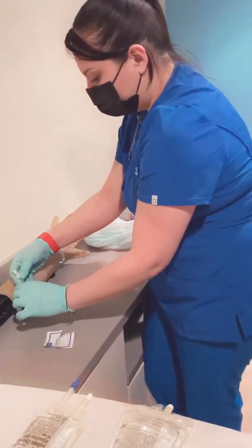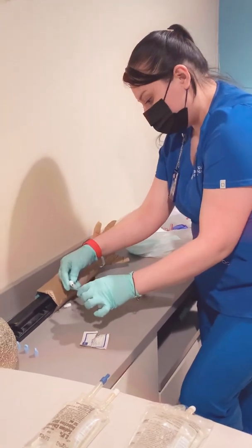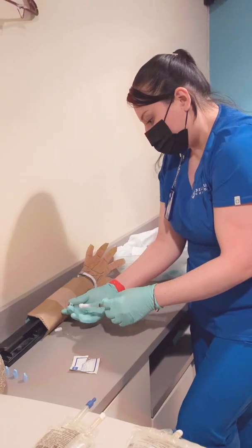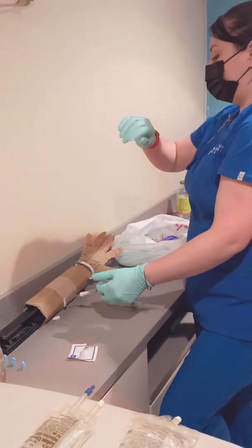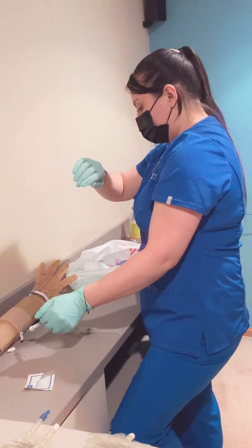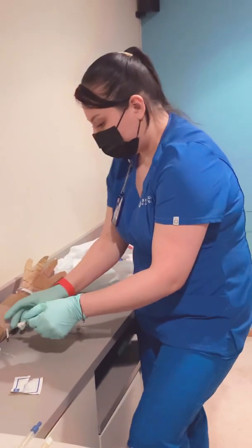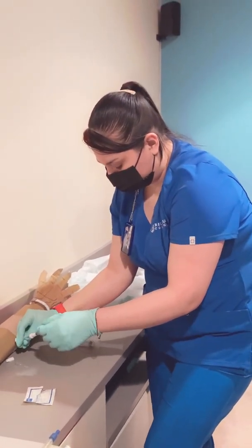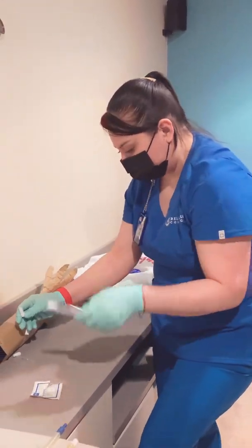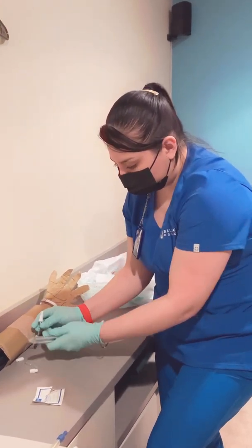And now I'm going to grab the syringe that contains the ondansetron medication. I'm going to sterilely remove the needle and attach to the hub. And I'm going to unclamp and deliver this medication at a rate of 2 minutes. Slowly. Okay. Then I'm going to clamp, remove, and I'm going to flush my medication so the medication won't stay in the line.